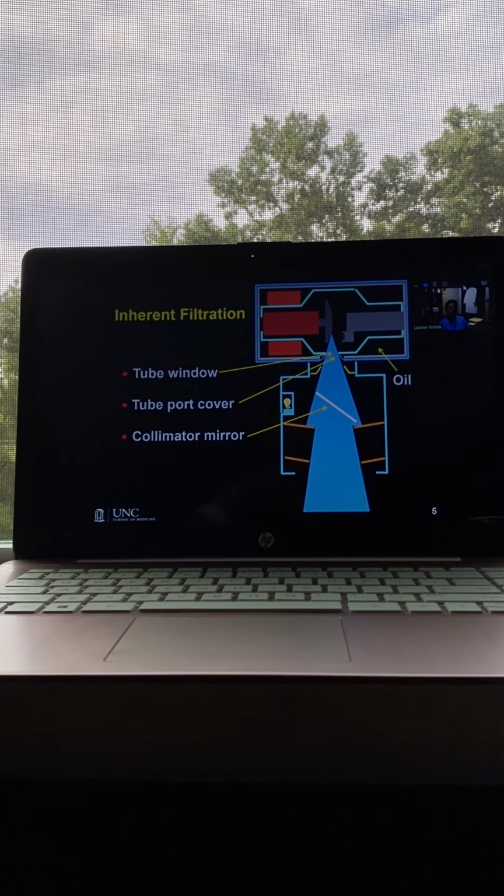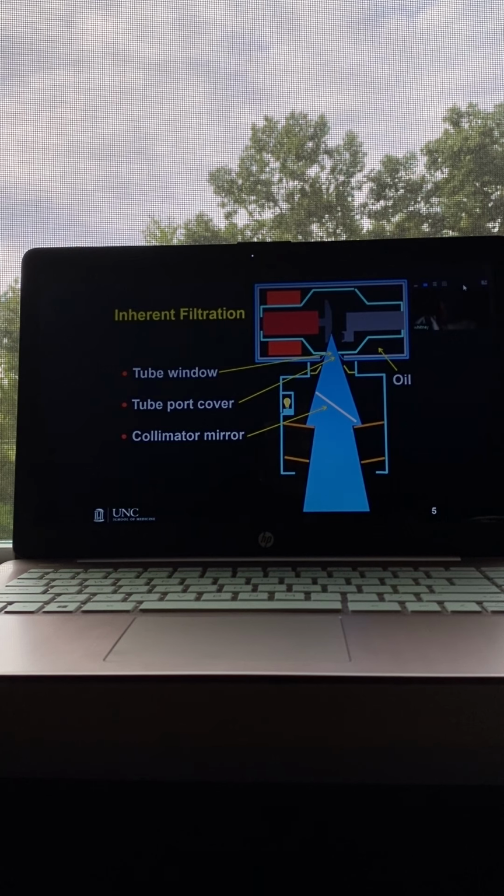But when you press that light on the collimator, the light shines, hits the mirror, and then it gets reflected down this direction. Why do we have to have the mirror? Why can't we have this light bulb right here in the middle of the path? It would get in the way of the x-rays coming down.